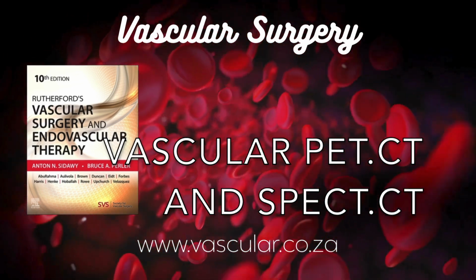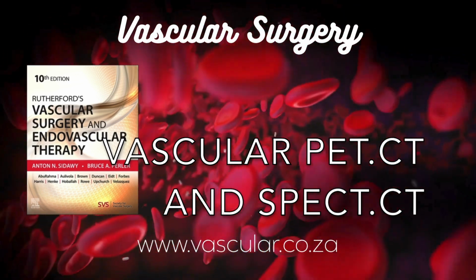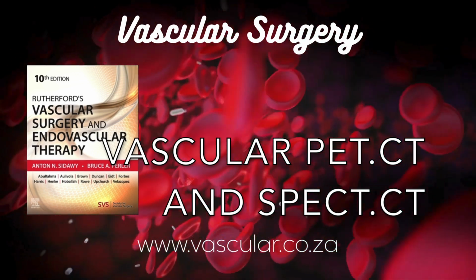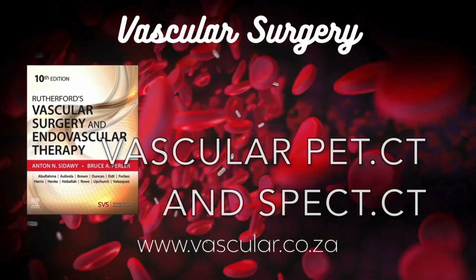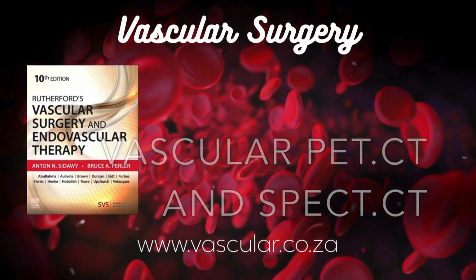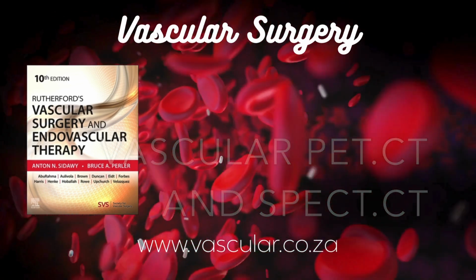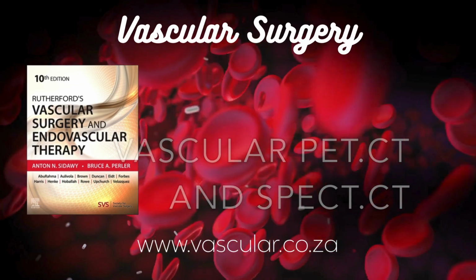And does this inflammation change over time? It seems to. Studies following patients with repeat scans show that vascular wall FDG uptake can fluctuate. Inflammation might be more of a transient feature, waxing and waning, while calcification is more of a cumulative, chronic marker. Which has implications for trials testing anti-inflammatory drugs. Exactly. You need to capture that dynamic process.